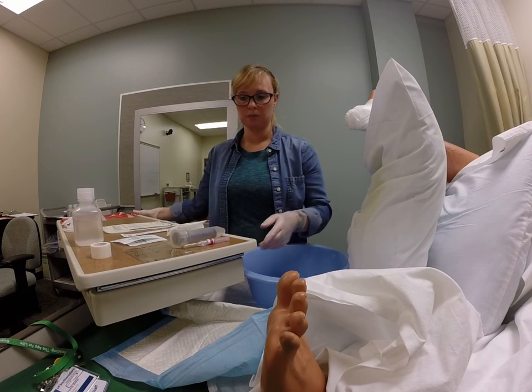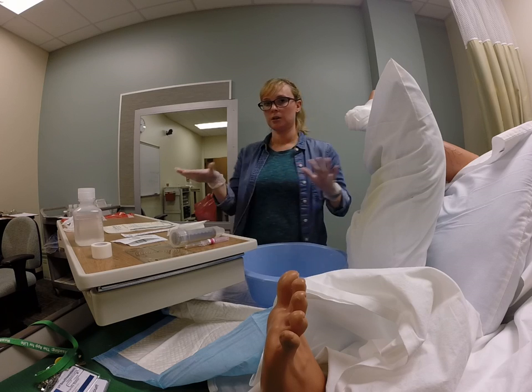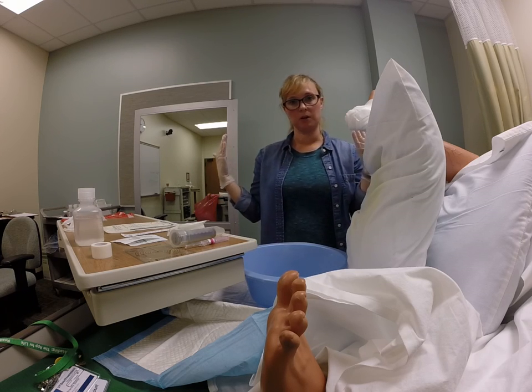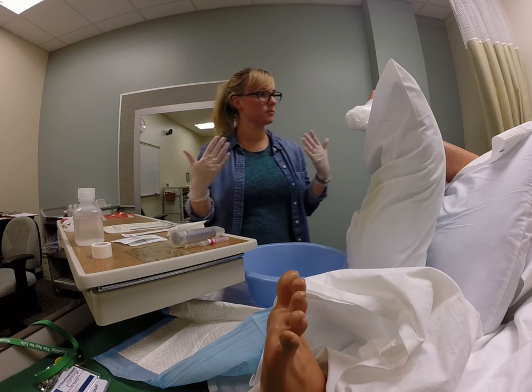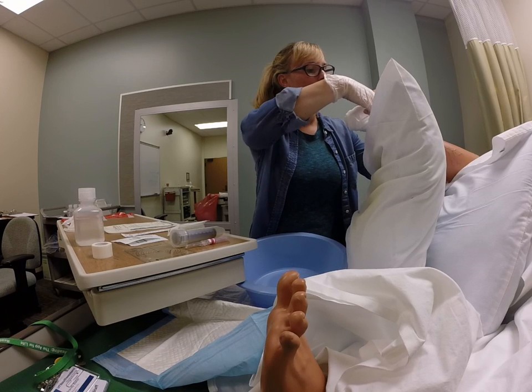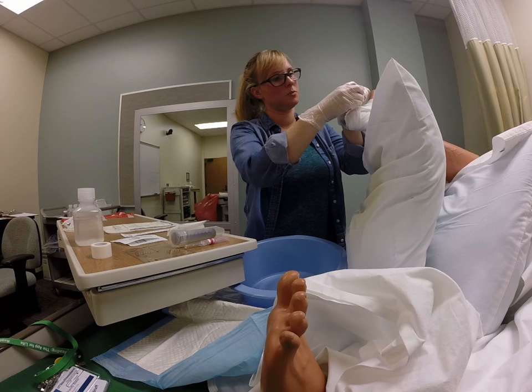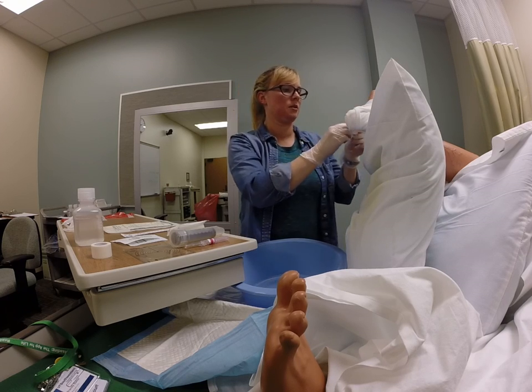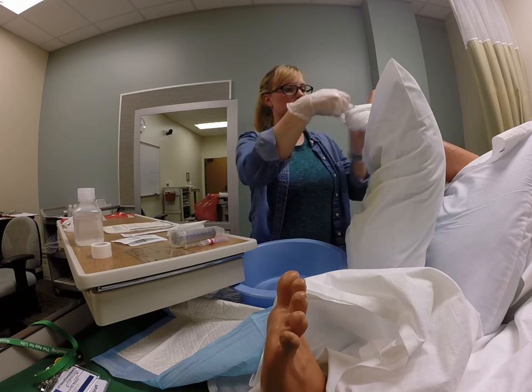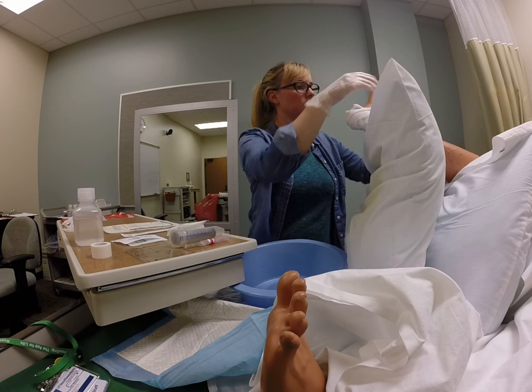My biohazard bag is already on my table, and again, I want you to just look at my setup. My tray is all the way over the bed. It's not off to the side over here, okay? So I'm not doing a lot of twisting, so nothing's going to be out of my field of vision. So clean gloves, remove the old dressing. If you've got bandage scissors, you can use them, just be careful. Do it the old way, which takes a while. And notice I'm wadding this up as I go so it's not draping all over the bed.